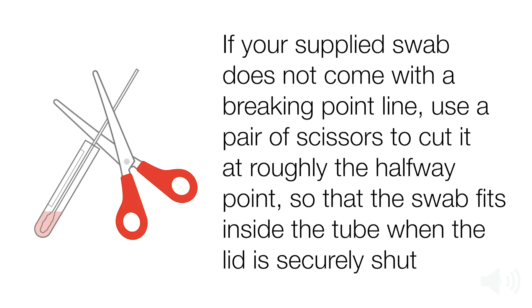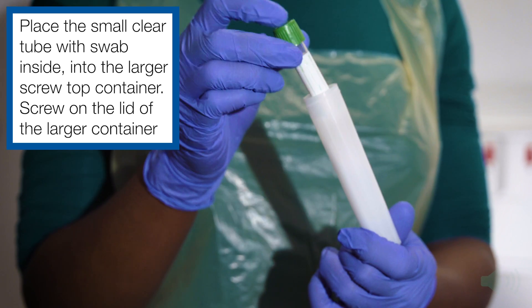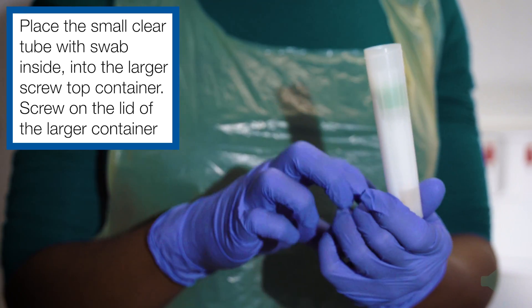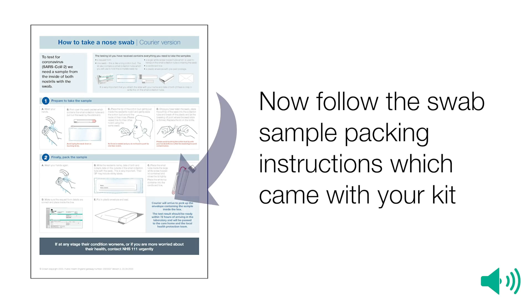If your supplied swab does not come with a breaking point line, use a pair of scissors to cut it at roughly the halfway point so that the swab fits inside the tube when the lid is securely shut. Place the small clear tube with the swab inside into the larger screw-top container and screw on the lid.